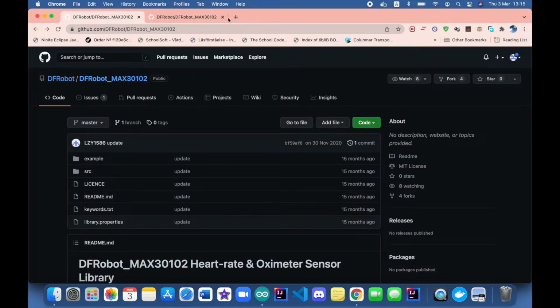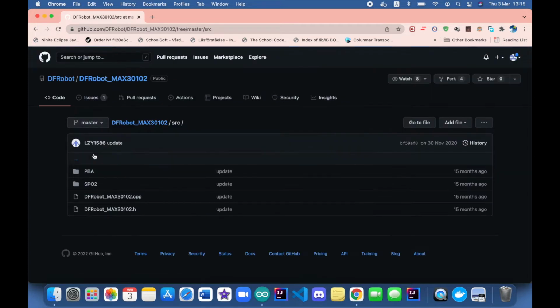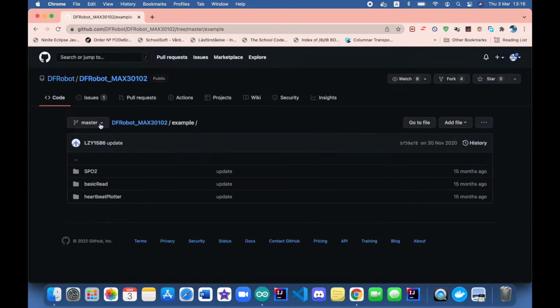Oh, I have it opened here. On their GitHub account, they have examples, they have the sources, the libraries that they use, the original libraries. You can have a look here as well. They use MAXrefdes117. So there are so many different libraries. This was the best one so far, because this is made from the original libraries. You have some examples here. SpO2 is the one that I'm using.